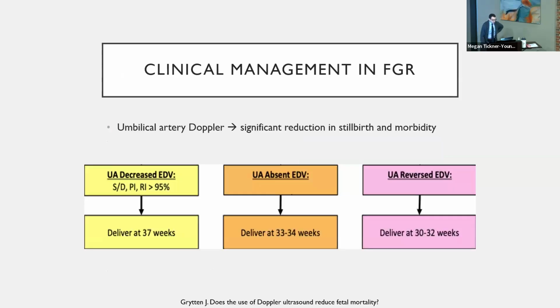So everybody knows FGR management based on umbilical artery Doppler findings. The studies of associated critical Doppler findings with stillbirth have made such a tremendous impact on how we practice. There are multiple studies that have shown how monitoring the umbilical arteries in FGR can significantly reduce perinatal death by aiding providers with a clear indication for delivery, with reports as high as 30% reduction rate in fetal death.